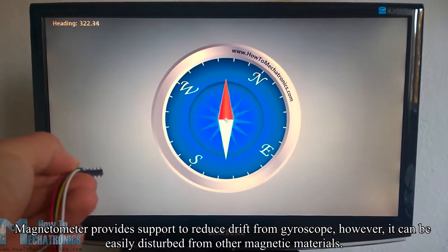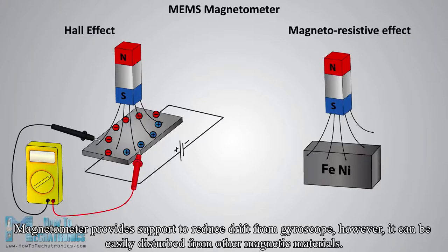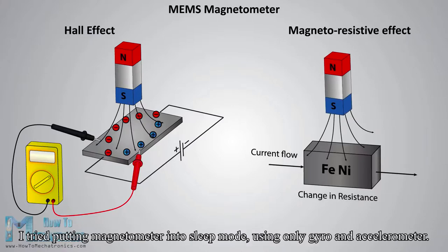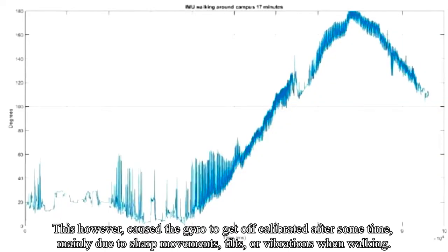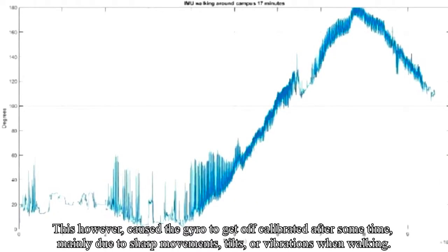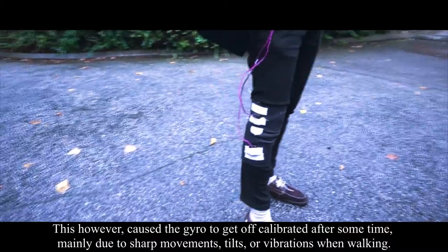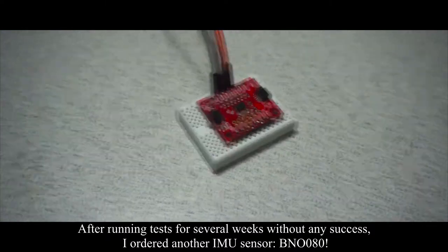The magnetometer provides support to reduce drift from the gyroscope; however, it can be easily disturbed by other magnetic materials. I tried putting the magnetometer into sleep mode, using only the gyroscope and accelerometer. This caused the gyroscope to get off-calibrated after some time, mainly due to sharp movements, tilts, or vibrations when walking. After running tests for several weeks without success, I ordered another sensor: the BNO080.